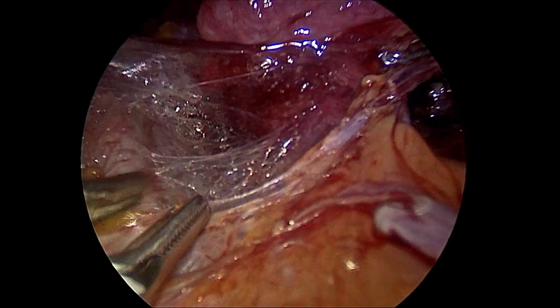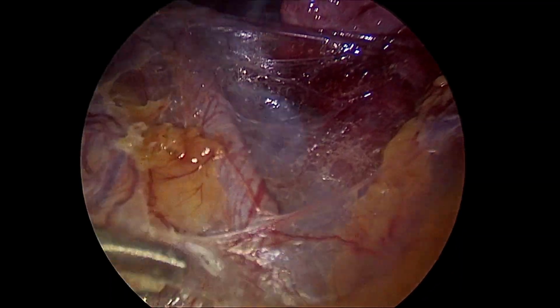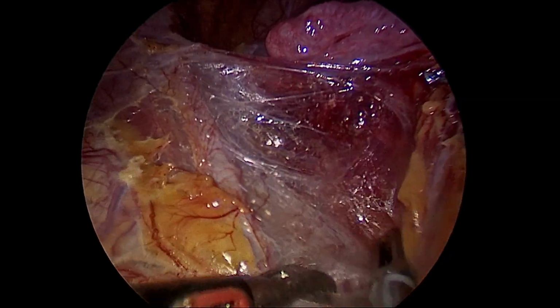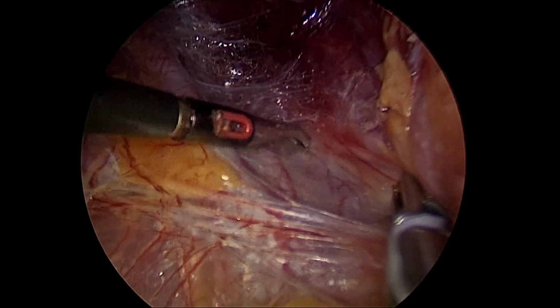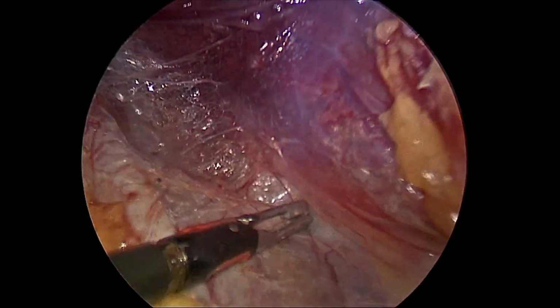So as you can see, we are dissecting with blunt and sharp dissections. Here we are trying to dissect the bowel more, and with the bowel grasper and the bipolar shearer, with simple strokes we will be seeing the ureter shortly.